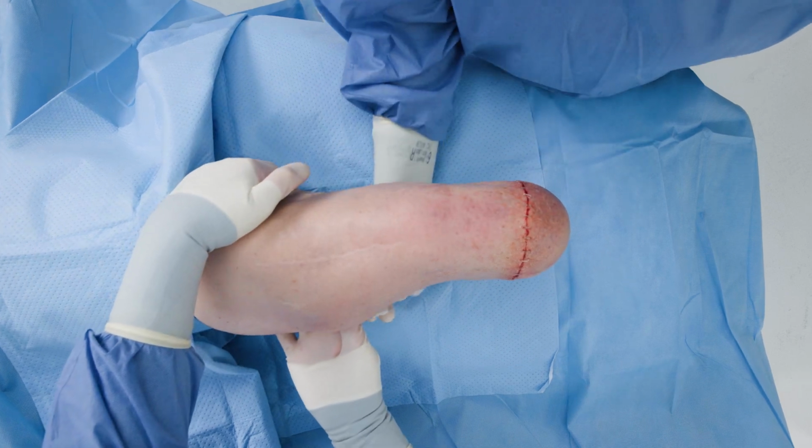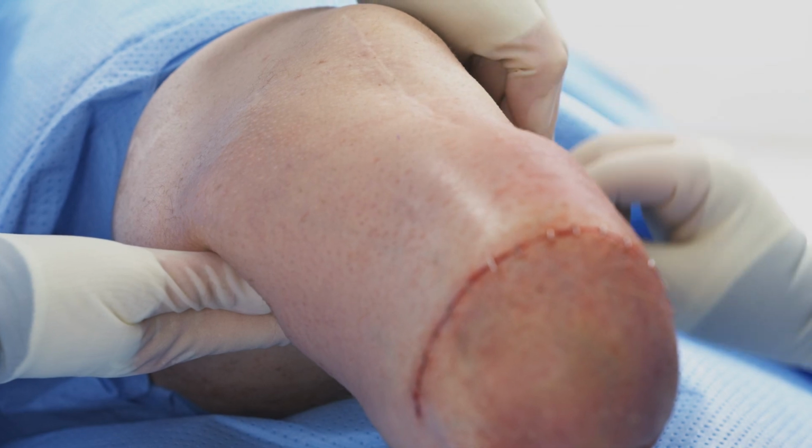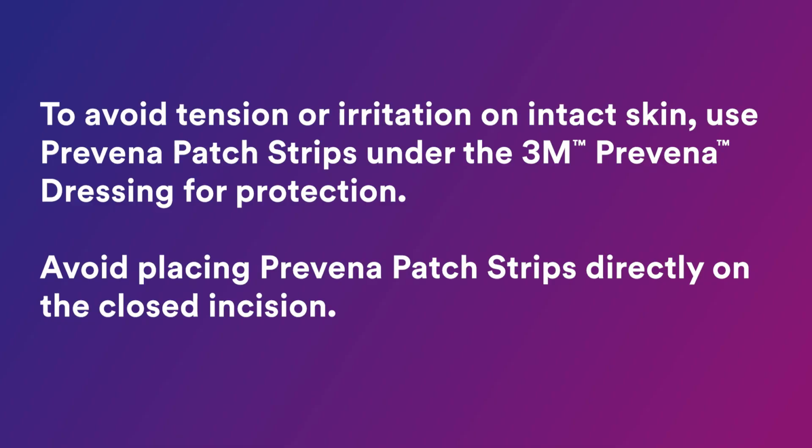Once incision and peri-wound skin is clean and dry, apply 3M Cavalon No-Sting Barrier Film to peri-wound skin to prepare the area. To avoid tension or irritation on intact skin, use Prevena patch strips under the 3M Prevena dressing for protection. Avoid placing Prevena patch strips directly on the closed incision.